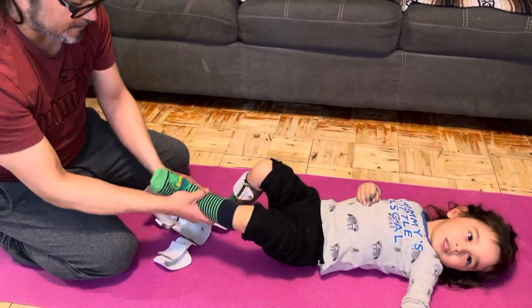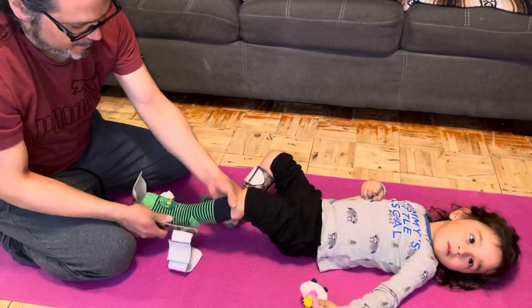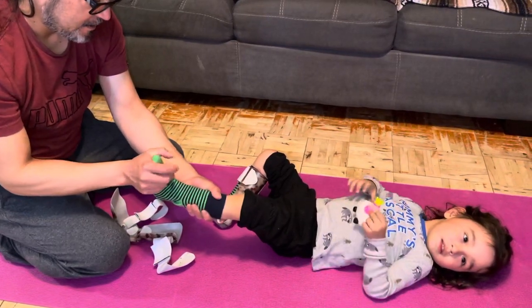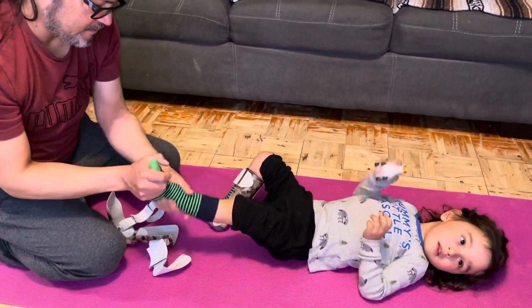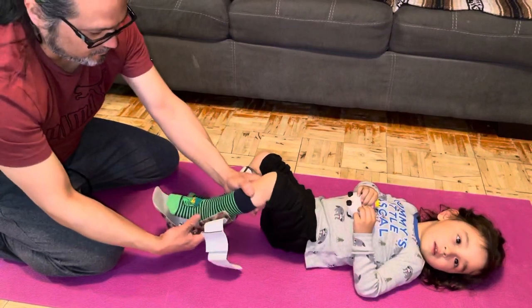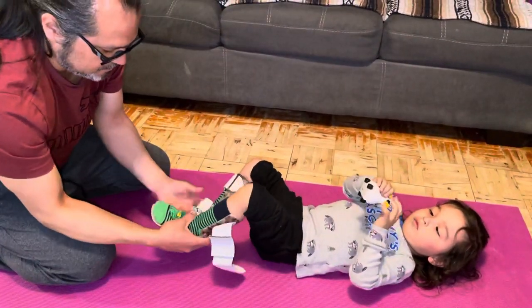If there are creases on the bottom it'll just be irritating when he walks. It's harder to put them on if he's not cooperating, because his calf muscle has a lot of tension at times, so it's a bit harder to stretch it up. Sometimes it won't go down all the way, but if you bend him at the knee, it takes some of that tension off and his ankle bends a lot easier.